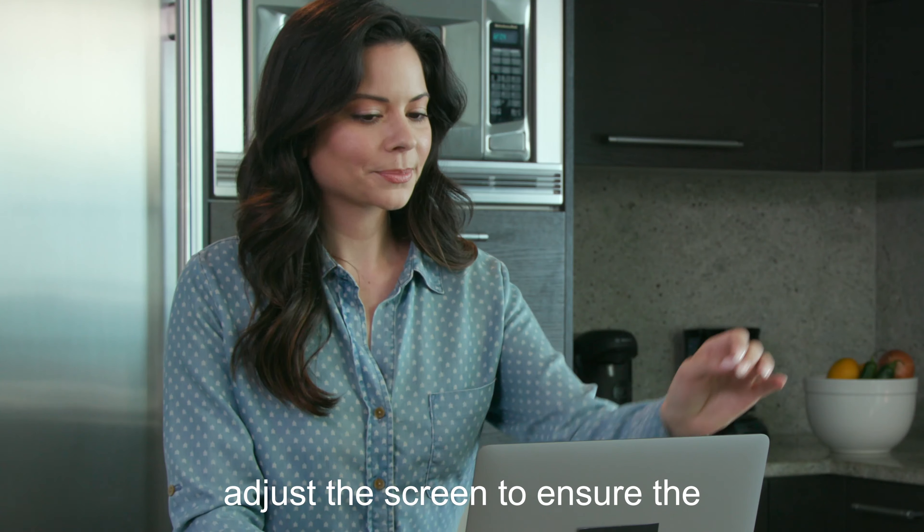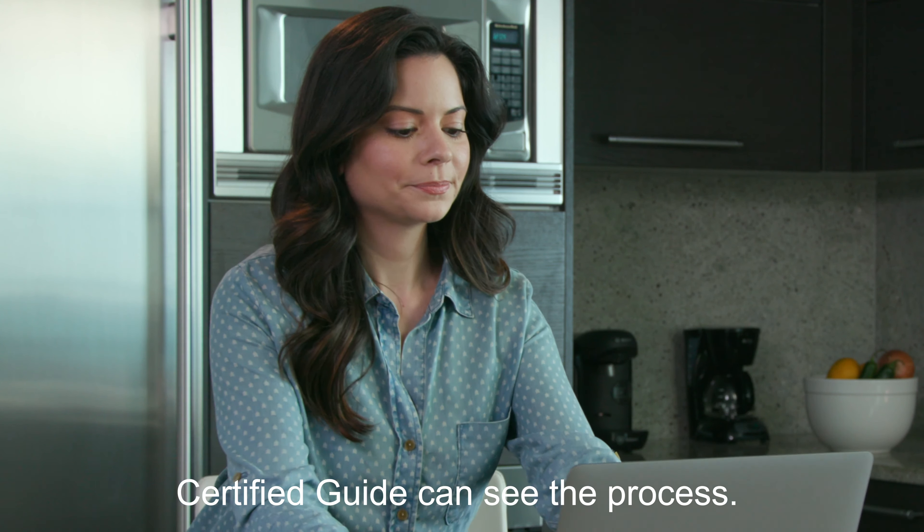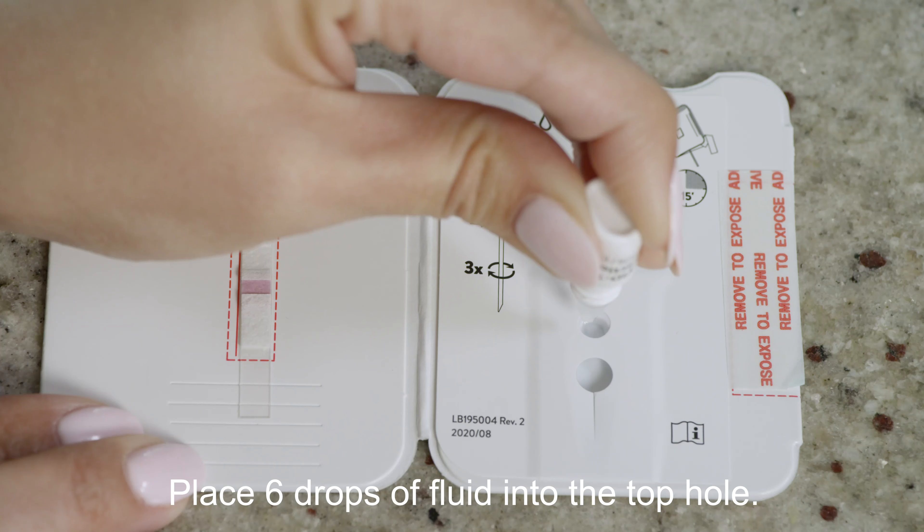After opening the card, adjust the screen to ensure the certified guide can see the process. Remove the dropper bottle cap and place six drops of fluid into the top hole.